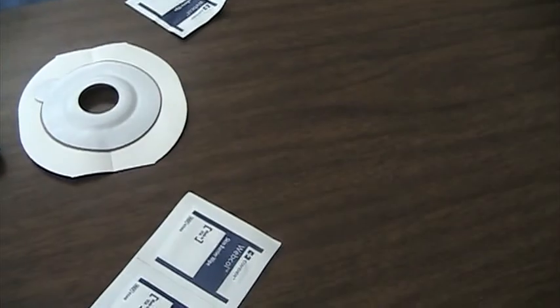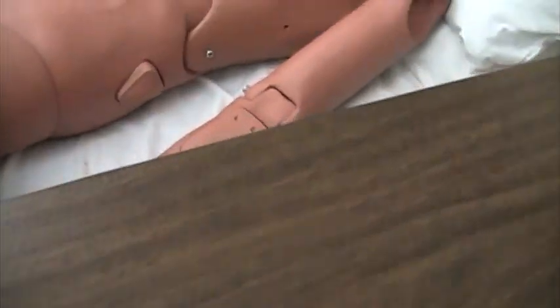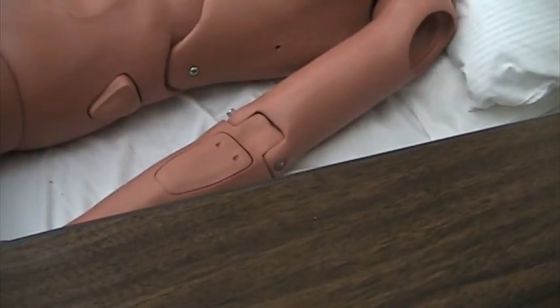I'm going to leave the actual measuring device out, as well as the skin barrier wipes. Try not to open them up and use them, but I'll leave them out, as well as some of the stoma adhesive or the wafers. Okay. Alright, and that is pretty much it on ostomy.